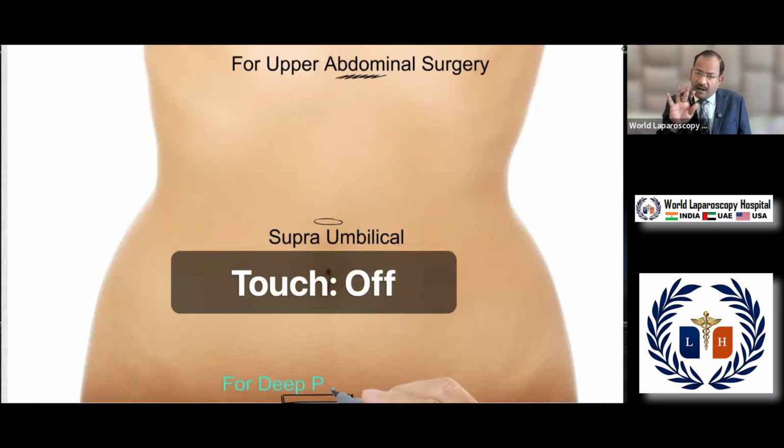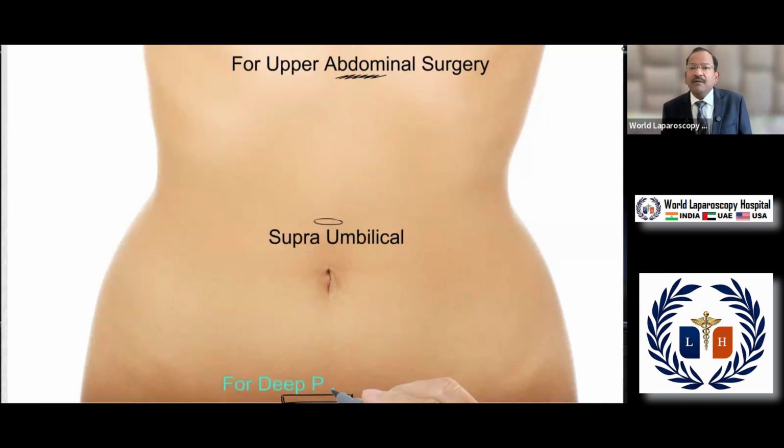Why? Because our laparoscopic instrument length is available in 4 lengths: 20, 28, after that 36 and 45.